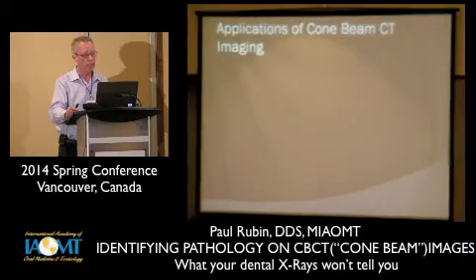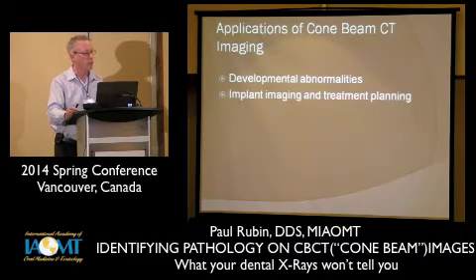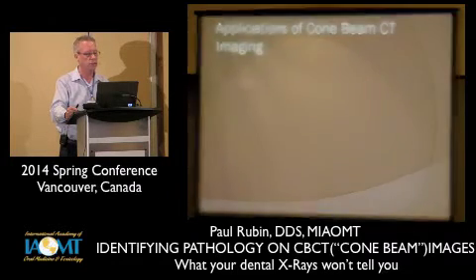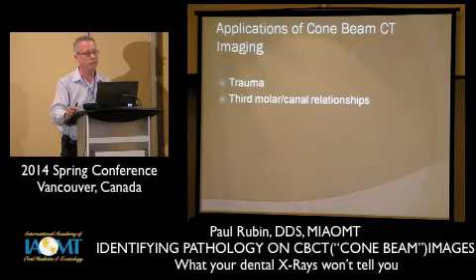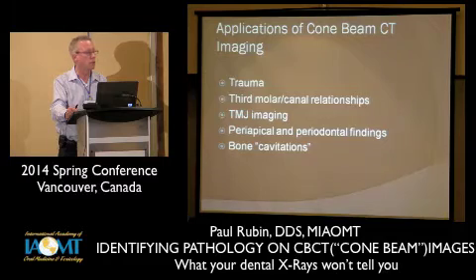When we look at applications for cone beam imaging, there are many, and I'll list these in no particular order. Looking at developmental abnormalities, implant imaging and treatment planning, orthodontics, airway space evaluation, pathological findings, trauma, the relationship between teeth, especially third molars, and the mandibular canal, TMJ imaging, periapical and periodontal findings, and bone cavitations.